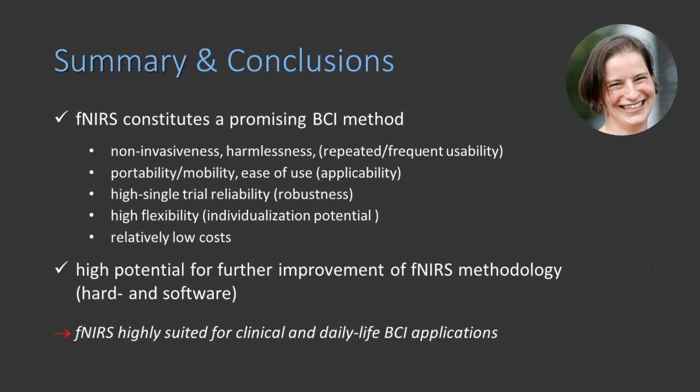The high single trial reliability can result in high robustness of the signal. I showed you many possibilities to build these BCIs because we can exploit fNIRS signal features very nicely. This brings along a high flexibility, so there's high individualization potential, and the costs are relatively low when you compare it to other methods.